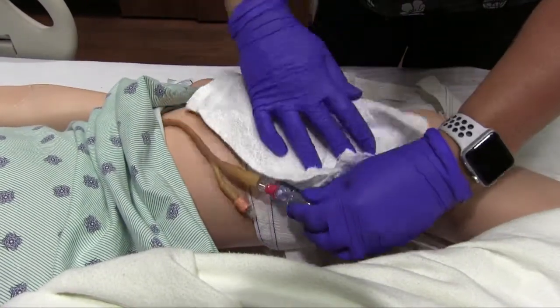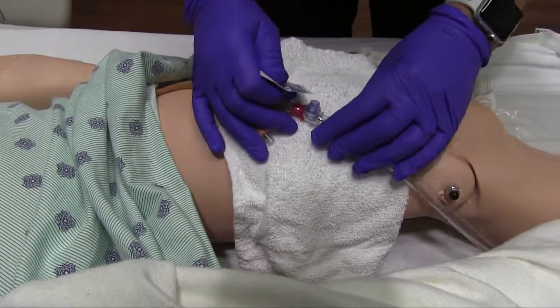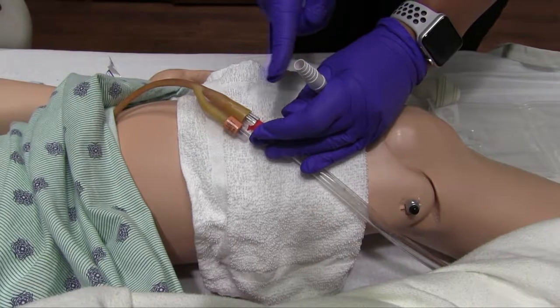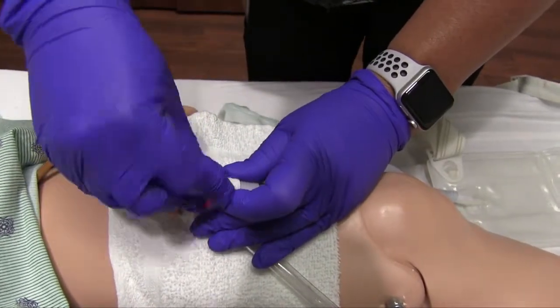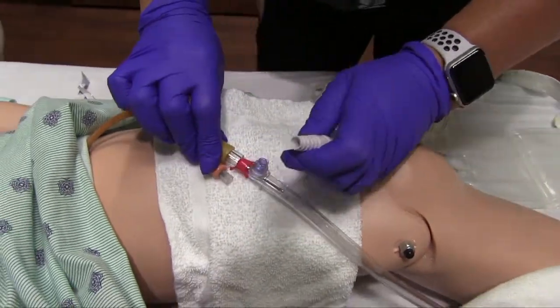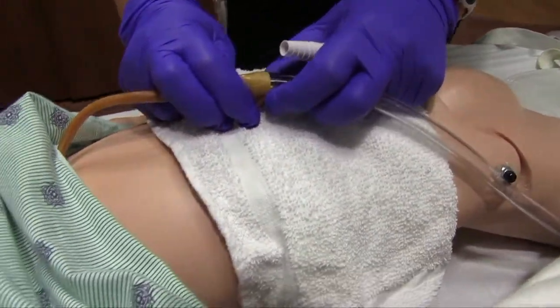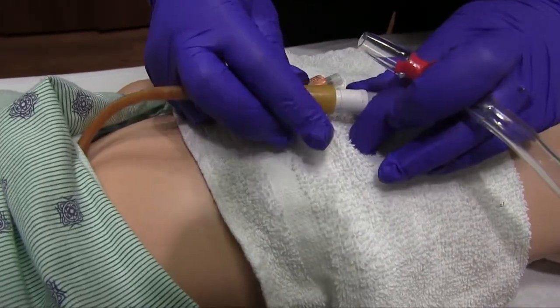So after you've done that, you can just put a towel in place, just in case you accidentally dribble a little urine, it'll catch it for you. And one really important thing is anytime you are going to place anything within this system, you need to clean the end going in with alcohol, okay? So you just take an alcohol wipe and you rub with some friction right around the tubing, just like so. And then you're going to pinch this here, use this thumb, and push this system up. And you just walk it up until they are released. Take your hand, push your new system in place. Okay?